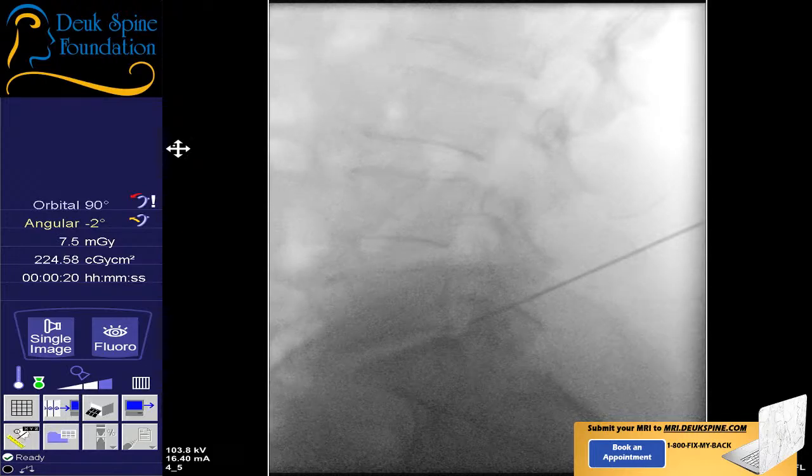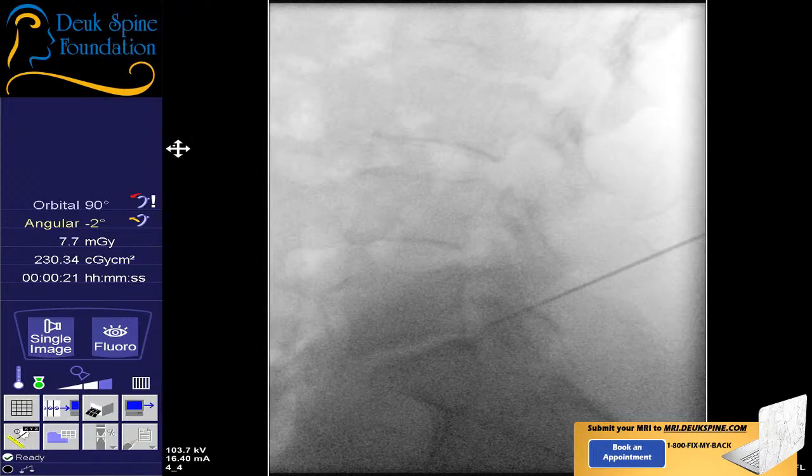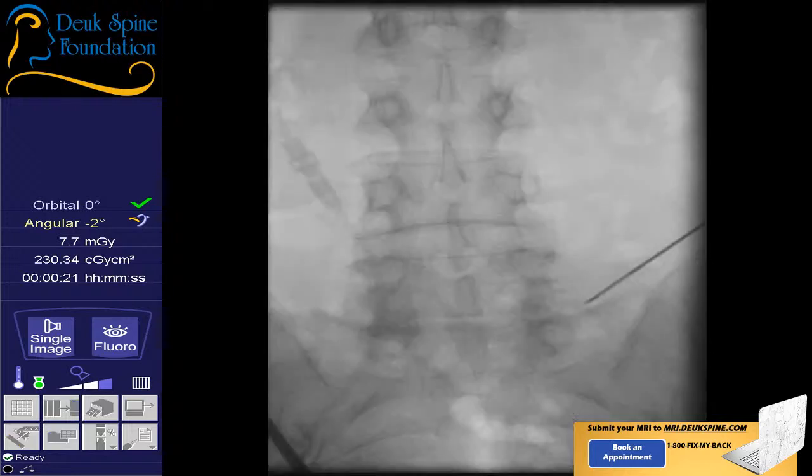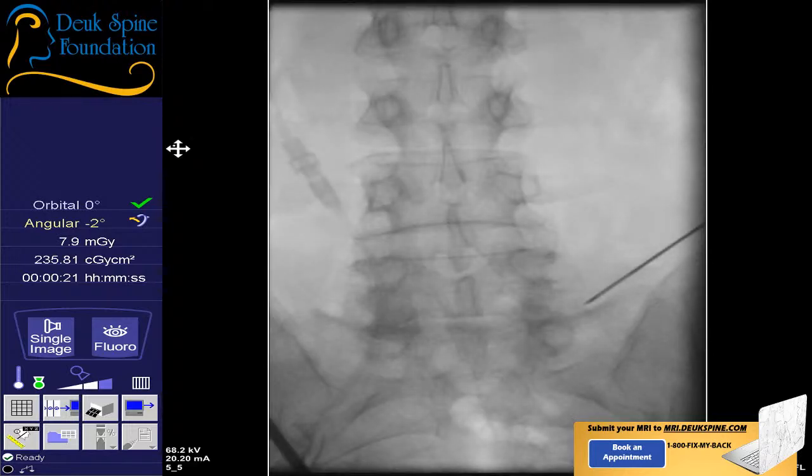You awake? All right. Dr. Deuk here. We're just getting everything in position, and then we're going to put you to sleep, okay? Are you comfortable? Do you feel any pain? Where? On the left side of your back? All right, let me see the lateral again. The lateral is there.